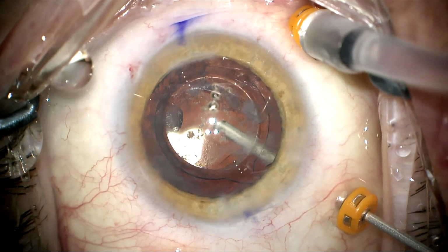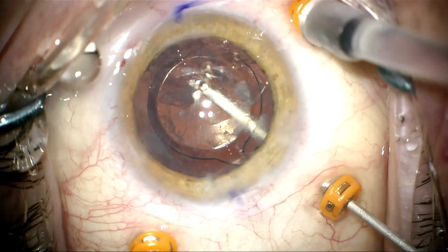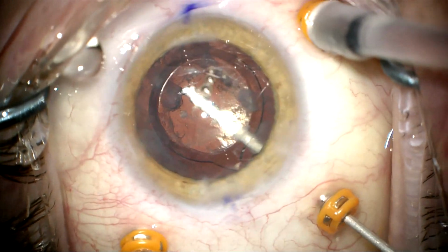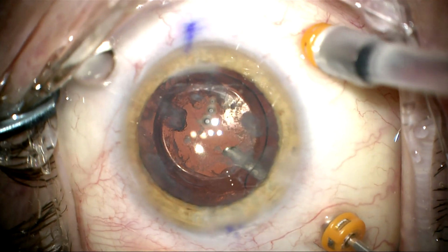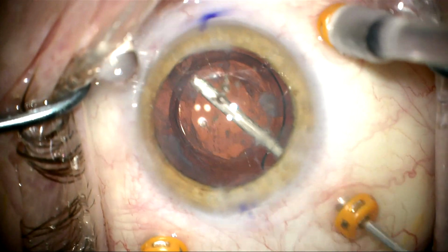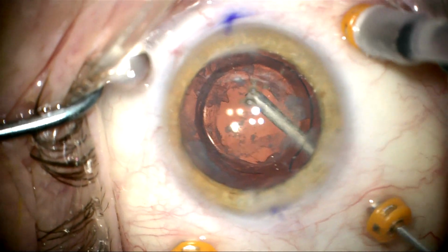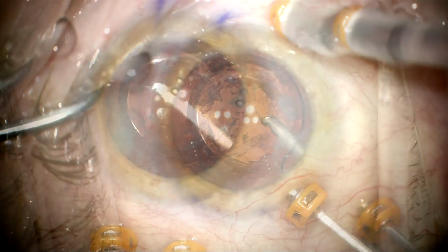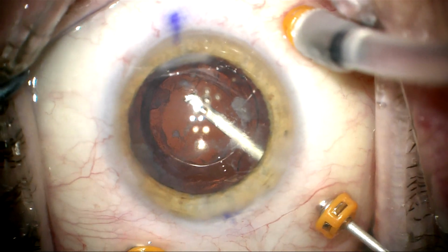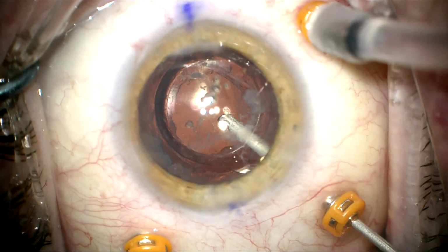So now we'll go through the pars plana and start doing a vitrectomy and removing some of this liberated material. This patient was also bothered by significant vitreous floaters. He had cloudy turbid vitreous, and we're going to clean that up as we remove some of the Soemmering's ring material that's kicked back into the vitreous as well. So here we're doing pars plana anterior vitrectomy.